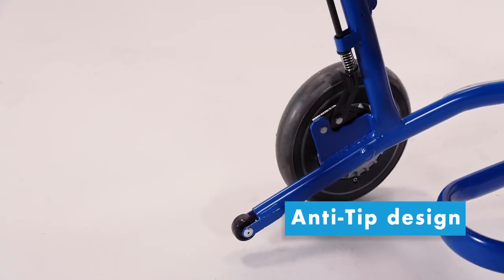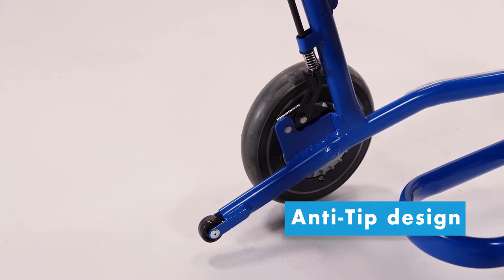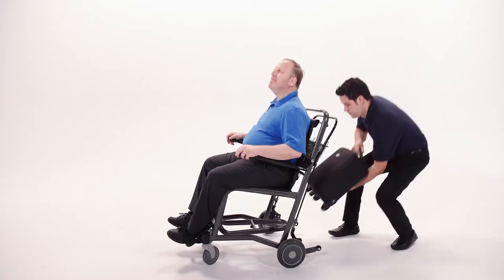The anti-tip designed frame is then painted utilizing a state-of-the-art powder coating process containing silver ions, giving the frame inherent antimicrobial properties with built-in luggage space.